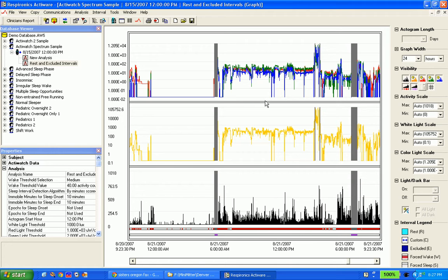So what we ended up doing was creating a graph using native paint functionality. This is just drawing a line from dot to dot to dot, calculating all of those different dots and saying, hey, draw a line from here to there. But what we also discovered was we're painting it to a picture box. The maximum number of pixels in a picture box is 32,000, and often we would have hundreds and hundreds of thousands of pixels to paint, particularly when you start expanding this. So what we ended up having to do was create multiple picture boxes and place them next to each other and paint them as we needed.